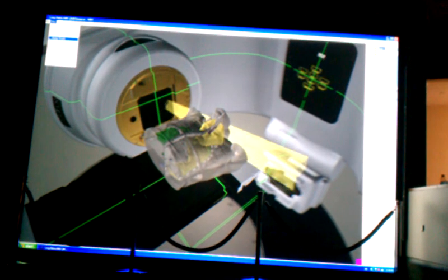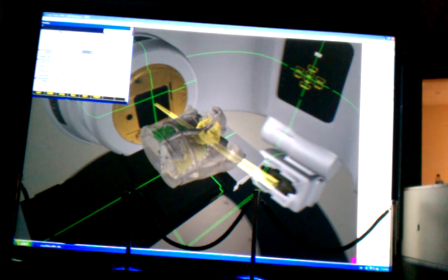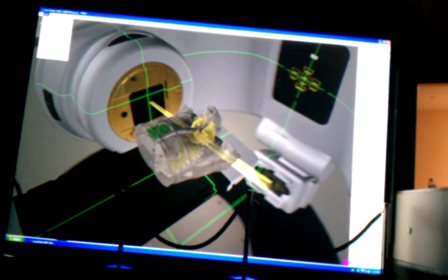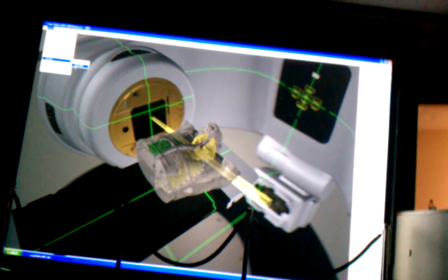So one of the things that we do in our radiation therapy program now is when our students go do a competency in the clinic, if they fail that competency, they must get the data from that patient, we feed it into the virtual system, and they must come in and treat with the faculty members on the virtual system until they treat the patient correctly before they go back in and try to demonstrate competency again. So it's really a phenomenal system.